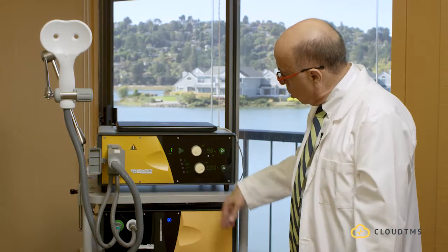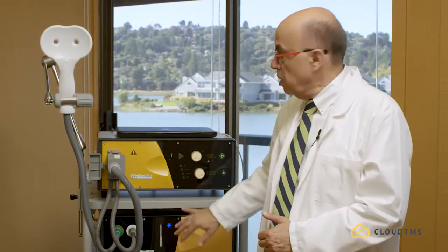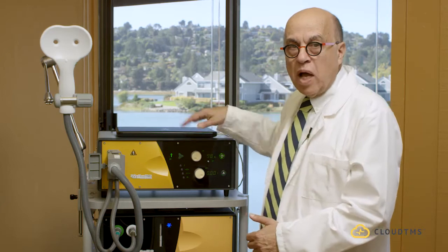I want to go over these buttons to show you how to set the machine up. Before doing this, I want to tell you that this machine can be run completely independently or through the laptop. I will go over the independent operation first.